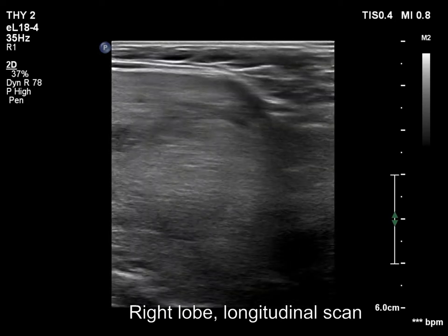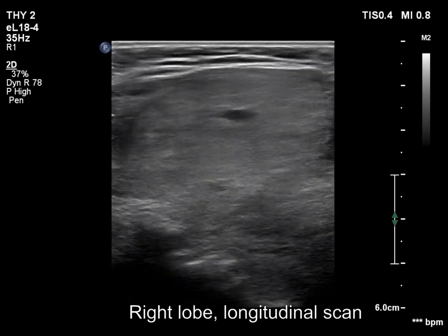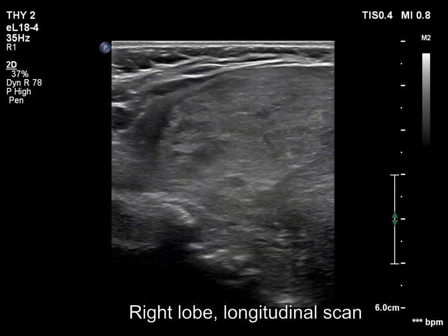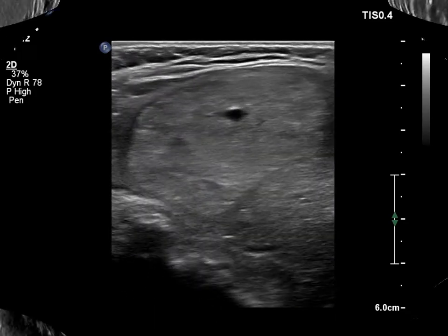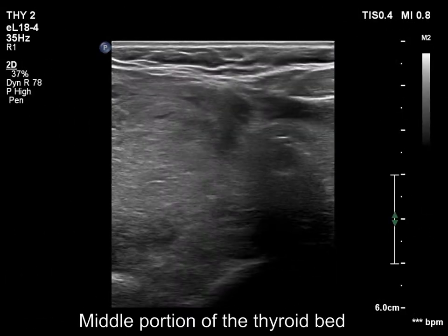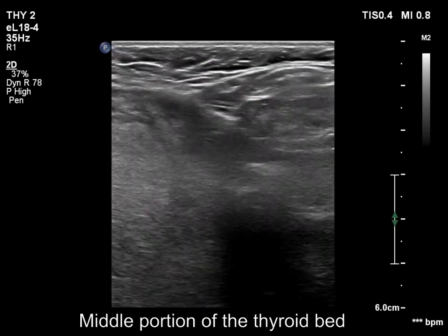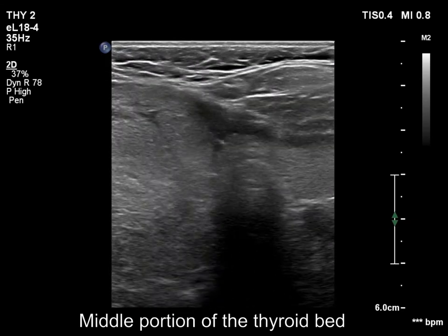It is not absolutely sure that the lower pole is visible. The goiter causes compression of the trachea.